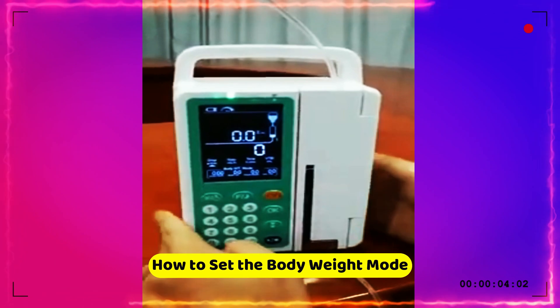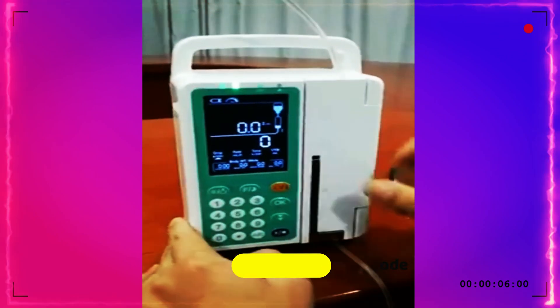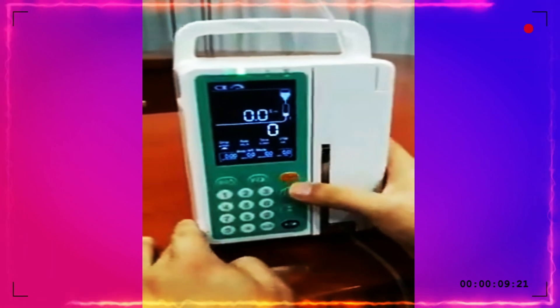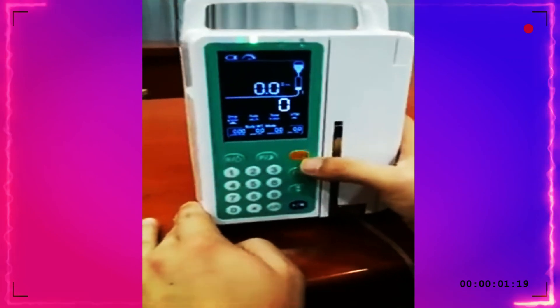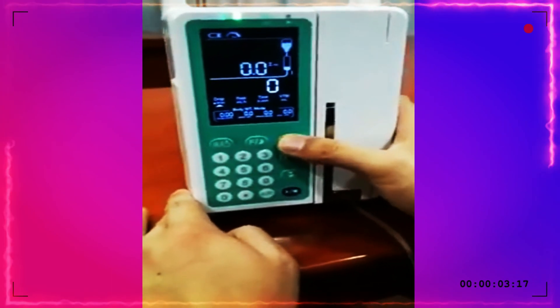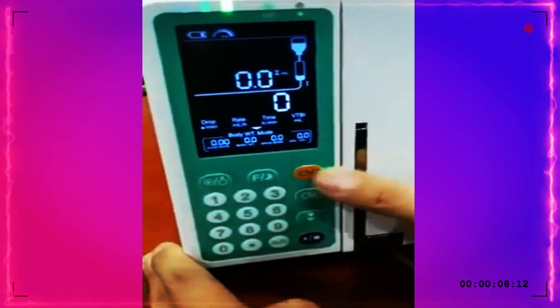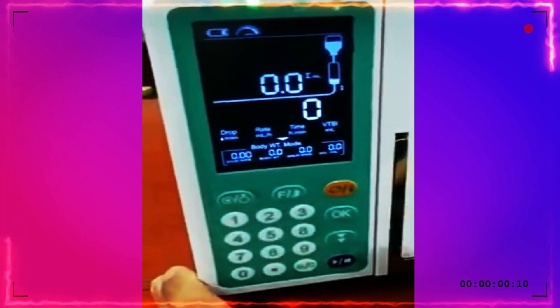Now I'll show you how to set the body weight mode. Turn on the infusion pump. There is the selection button — press this one to change between rate, time, VTBI, and body weight. Navigate to body weight and press OK.